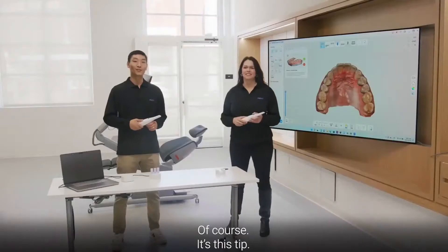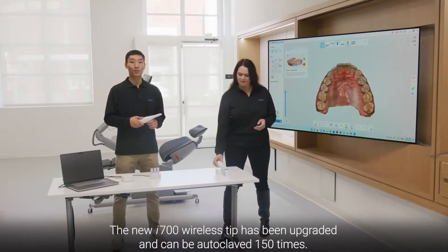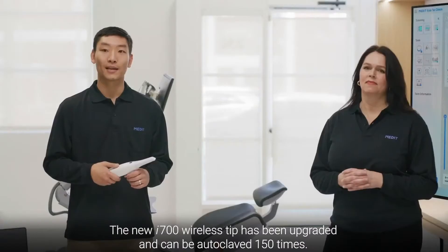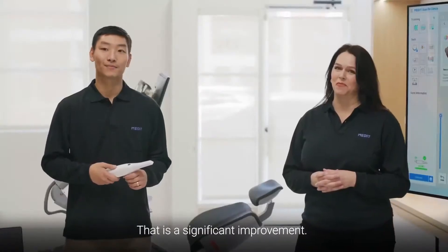And there's a surprise with this tip. The previous version of the reusable tip could be autoclaved up to 100 times. The new i700 Wireless tip has been upgraded and can be autoclaved 150 times. That's a significant improvement.